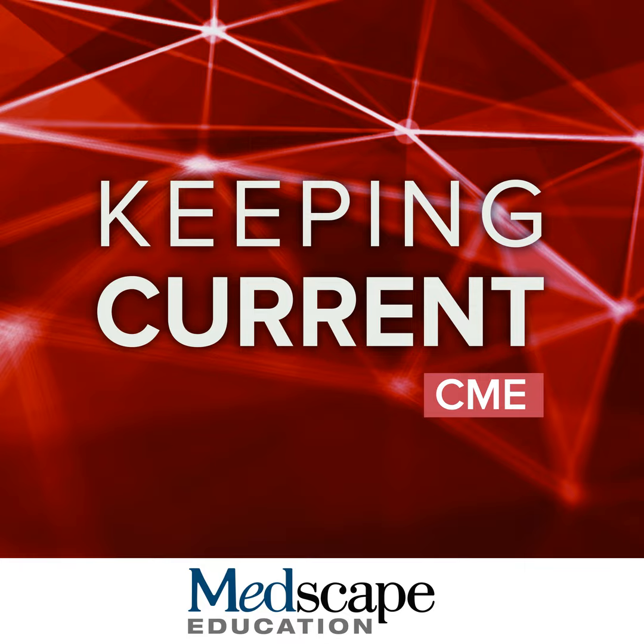Currently, there are three liver-specific MR contrast agents that are available, of which two, gadoxetic acid and gadobenate, are available in the United States. And for the purposes of this discussion, we're going to focus on gadoxetic acid because generally this is the one that's used most commonly because, as you can see, about 50% of it gets excreted into the biliary tree, and the hepatobiliary phase is obtained at 20 minutes, which makes it much more technically useful.